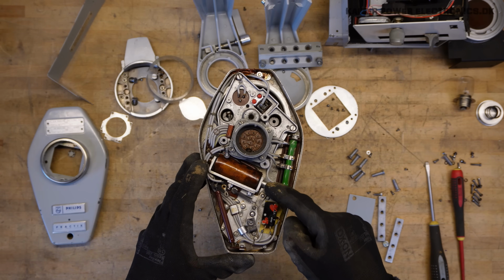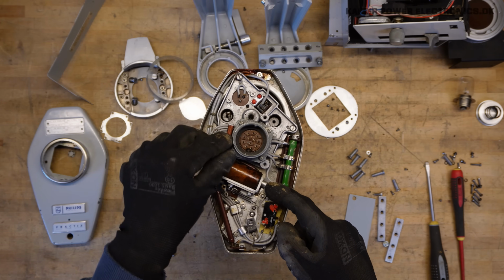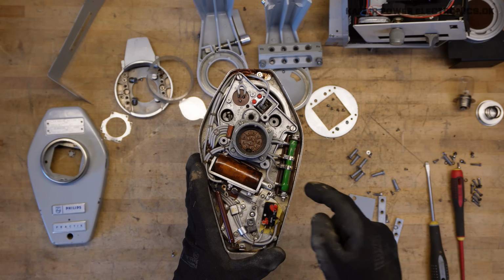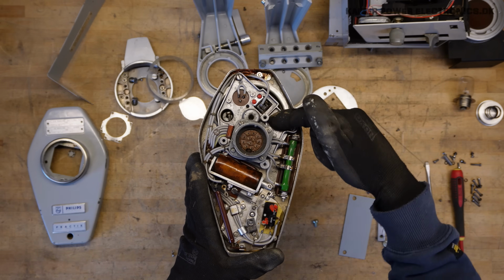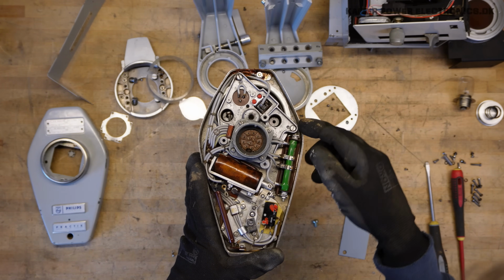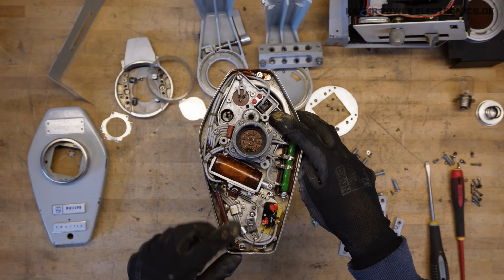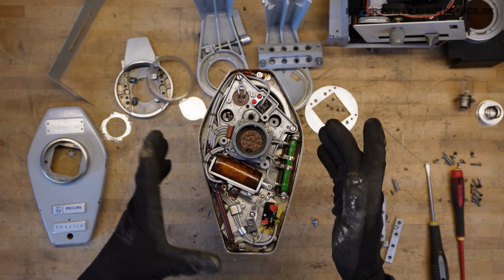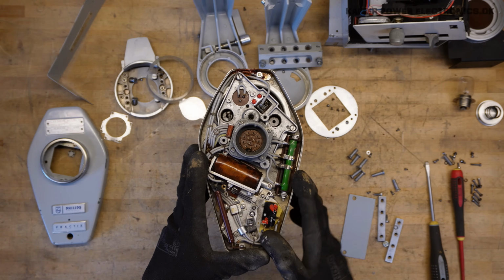So there is actually a local actuator to turn it on, most likely one of the safety features. Up here we have some more stuff, some kind of rotational switches maybe. It has to be in a certain position to actually be able to produce X-rays, so you cannot point it straight forward; it has to point down.